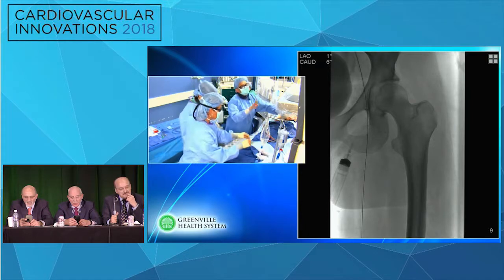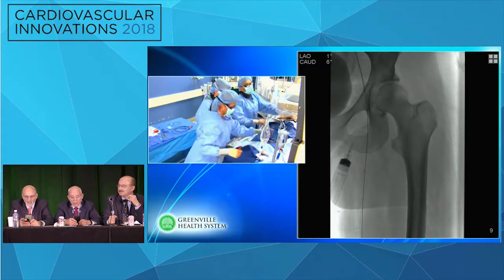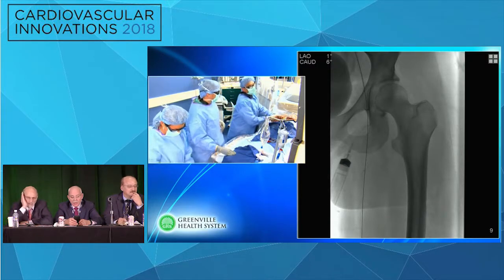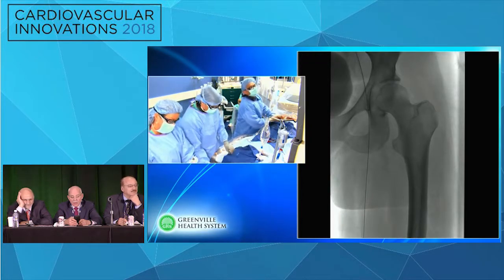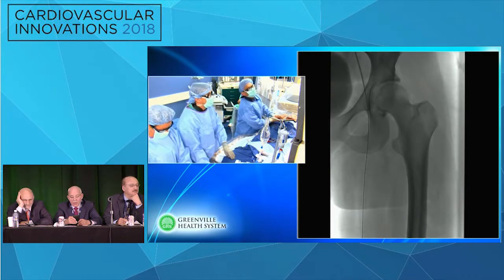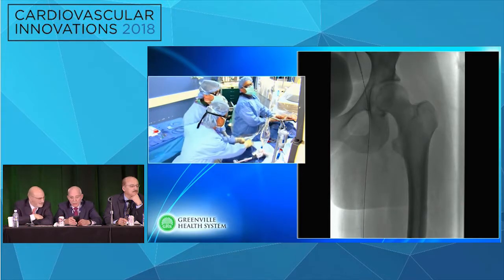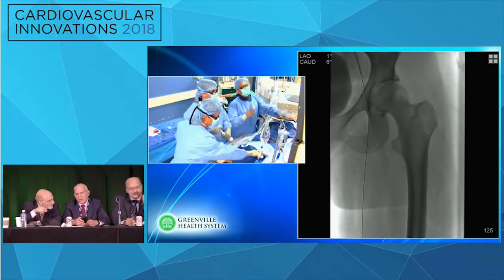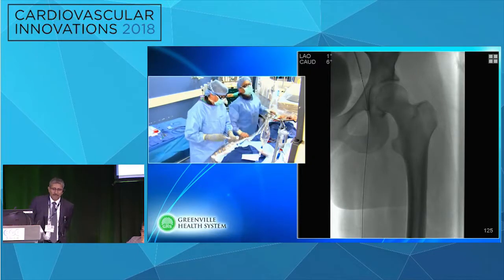Well, my concern is she's young. Yes. She's young, and it's all about inflow. So everybody's making the same point. We need inflow to these iliac stents. Correct. And so part of it in my mind, that's why I went down and looked into the femoral vein. So now let me dilate through here. That wire's in the femoral vein. I like where it's at. Let's just dilate this. It's all about that inflow and whether or not you think you got enough, and that will predicate how low we got to make this stent, how low we got to put it in.